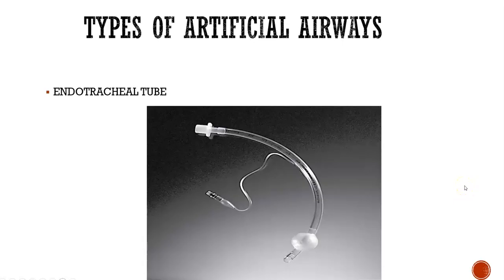One of my husband's cousins is a respiratory therapist, and she hates when people mess with her tubes. She's like, don't touch my tubes, I don't touch your drips. So sometimes, depending on your respiratory therapist, especially if you work with them all the time and you have a good rapport with each other, they're okay with you inflating it just 1 mil or so, but 1 to 2 mils. Anything lower or more than that, you just need to go ahead and call them.